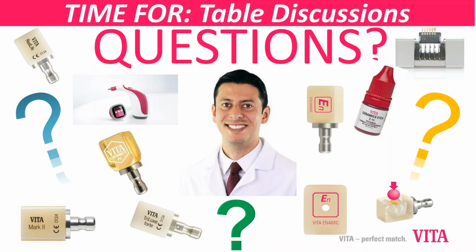But you know, in vitro studies are not always the solution for the clinical dilemma, Jim. I think that trying to have homogeneous thickness on your anterior restorations is always very helpful. So if you try to be in a range of 0.8 to 1 millimeter in all of them, your final outcome is going to be easier to achieve than if you have one veneer that is 0.3 and others that are 0.8 and a crown that is 1.2. When you have that type of salad scenario where it's very mixed up, then it's less predictable.